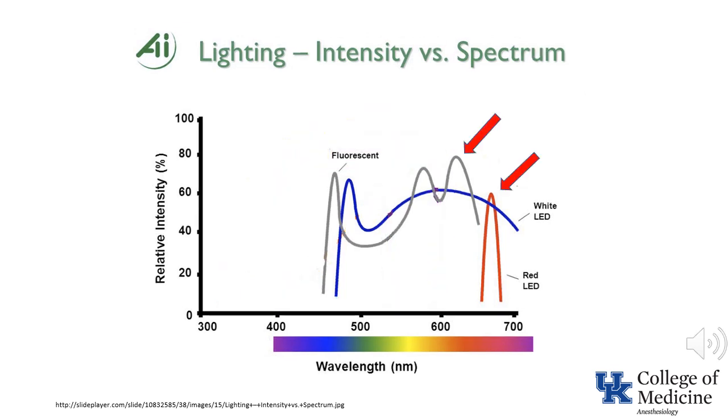Classically, fluorescent light is described as being the most likely to interfere with pulse oximetry readings. That's probably due to the fact that commonly used fluorescent lights have a wavelength peak near the wavelength used by the pulse oximeter. Perhaps the most interesting example of light interference is an experience I personally had about 3 years ago. After seeing my patient, a child, in the holding area, I returned to the OR to see if the resident was ready for the child.